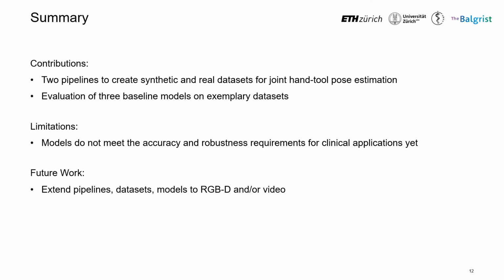The models do not yet meet the stringent accuracy and robustness requirements of clinical applications. However, they rely on only a single RGB image and can be extended in various ways to improve their performance. As future work, we want to extend the pipelines, datasets, and models to more modalities such as depth and video.